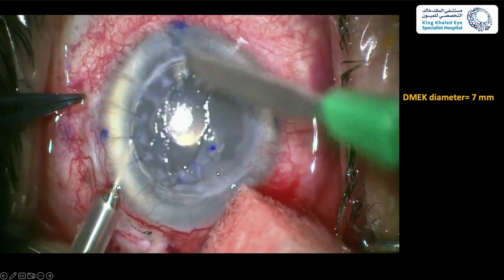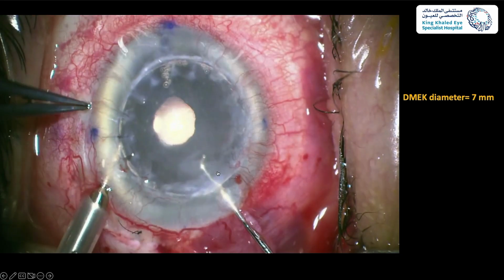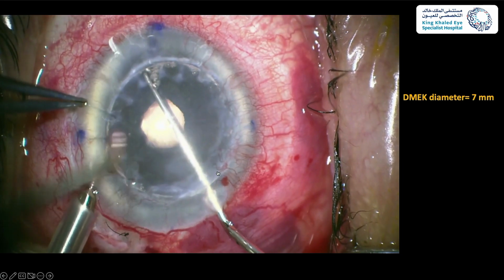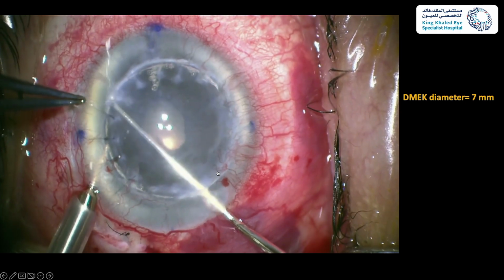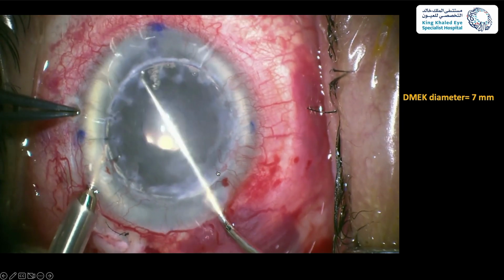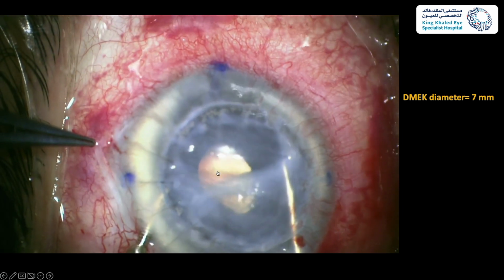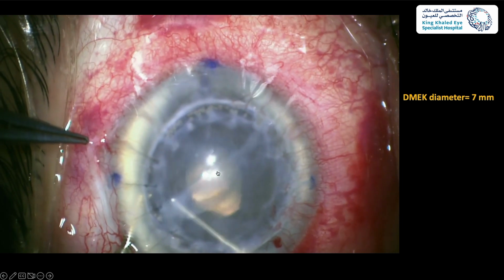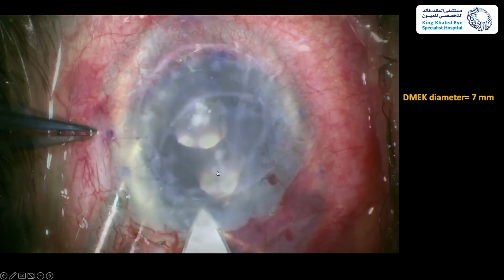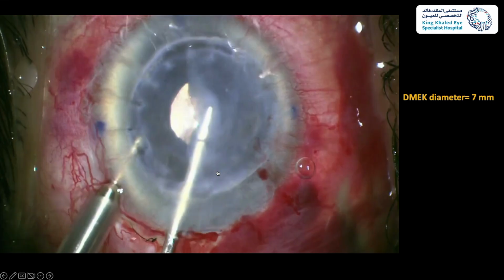Removing the epithelium to improve visualization. And then removal of the DM endothelium posterior stroma complex. You will still see some difficulties in the vertical cut. Then we'll use a vitrectomy scissor to cut the edges.